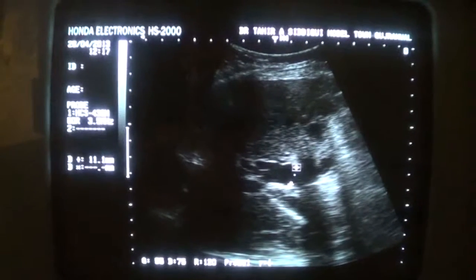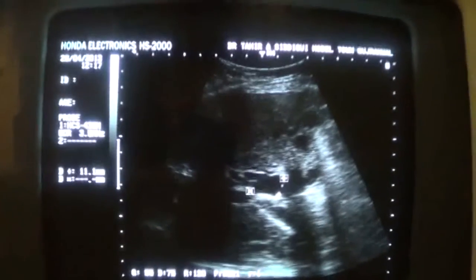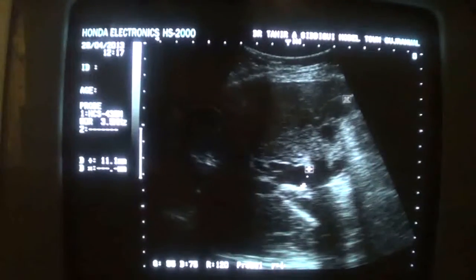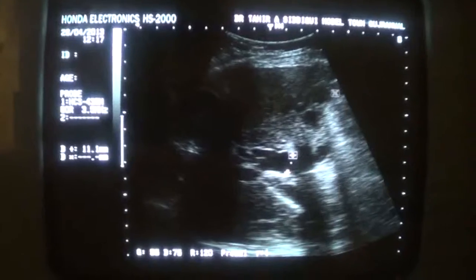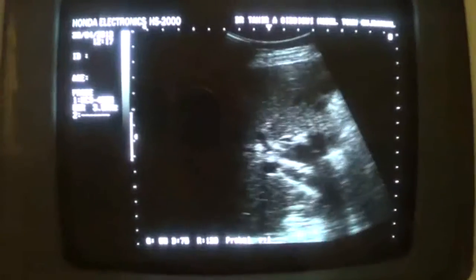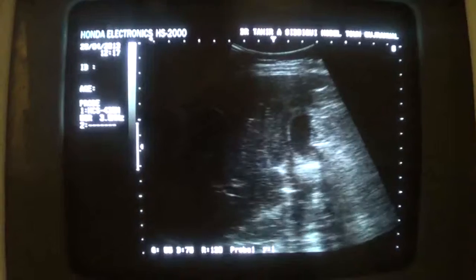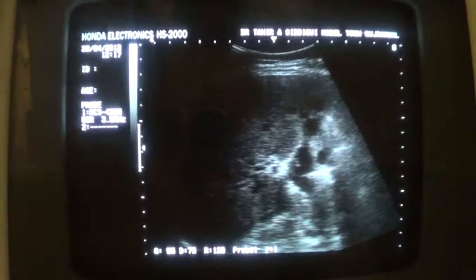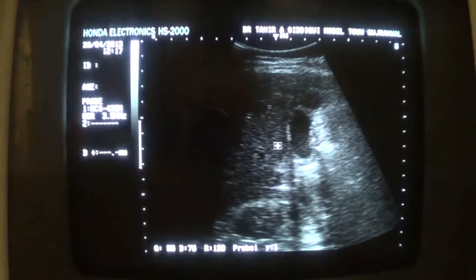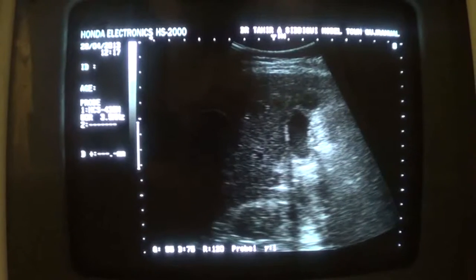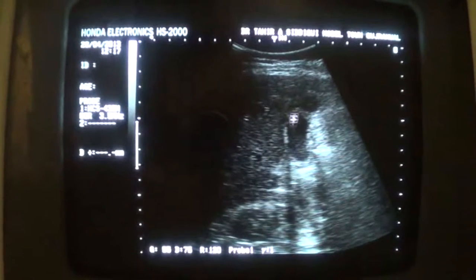This is the region of the porta hepatis. This is the hepatic artery in transverse section. This is the impression of the gallbladder. So this is the gallbladder. This is the gallbladder. Small amount of sludge.